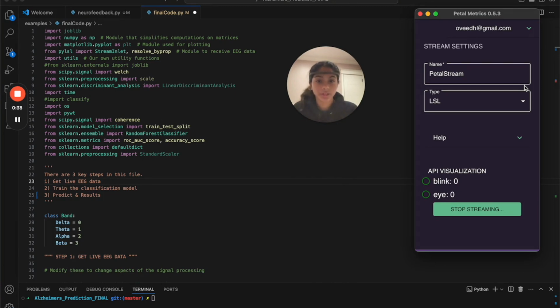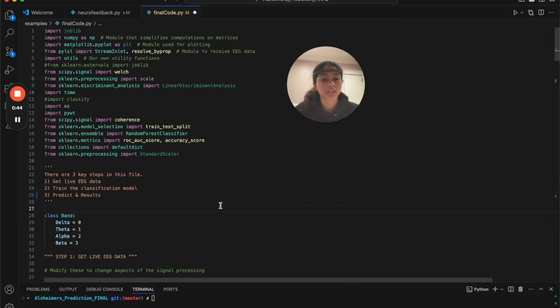The first thing we're going to do is ensure you have your Muse headset and your pedal metrics streaming and connected. So in this code, we're going to do three key things. The first is we're going to get our live EEG data. Second is train our classification model. And finally, input our live data into our classification model to get our predictions and get our results on whether a user has Alzheimer's or not.